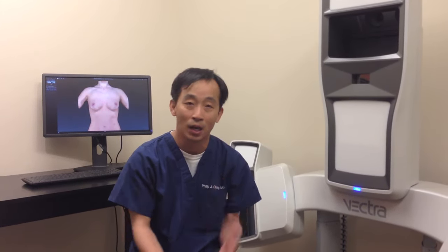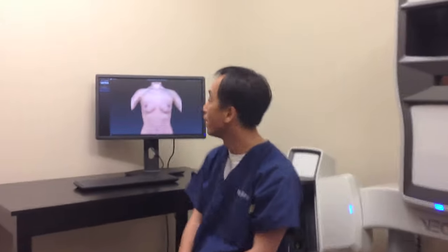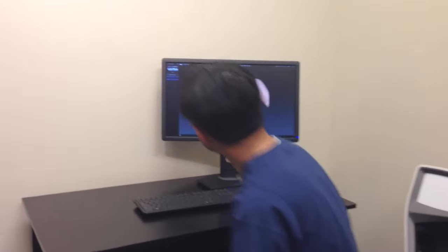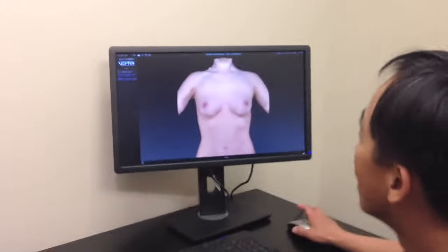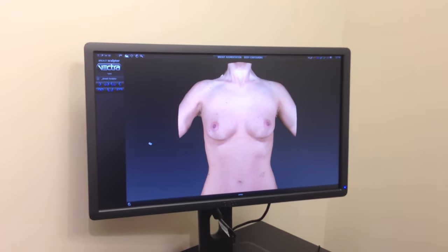And if we add a 300cc implant versus a 500cc implant, what they might appear like. So, this is the camera system and we're going to move over here where we already have a picture of a patient. And this is a preoperative picture of a patient that has desired a breast augmentation.